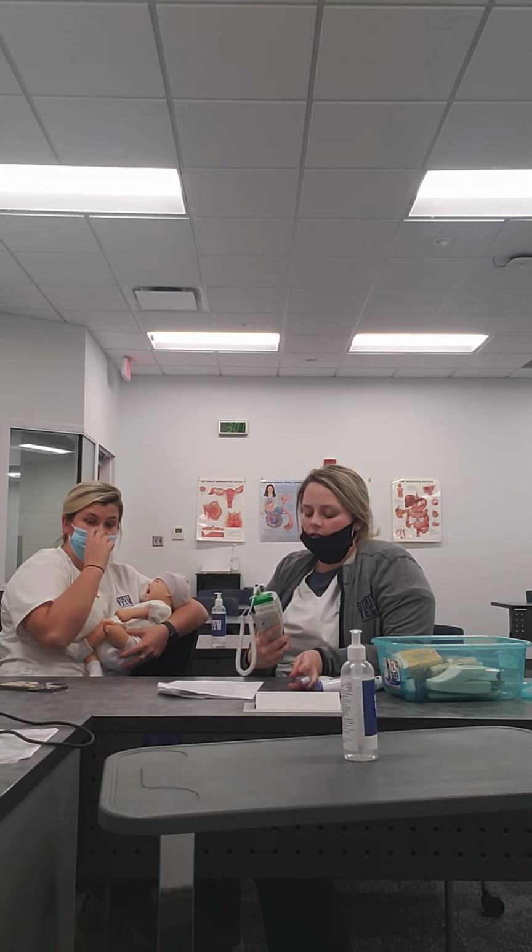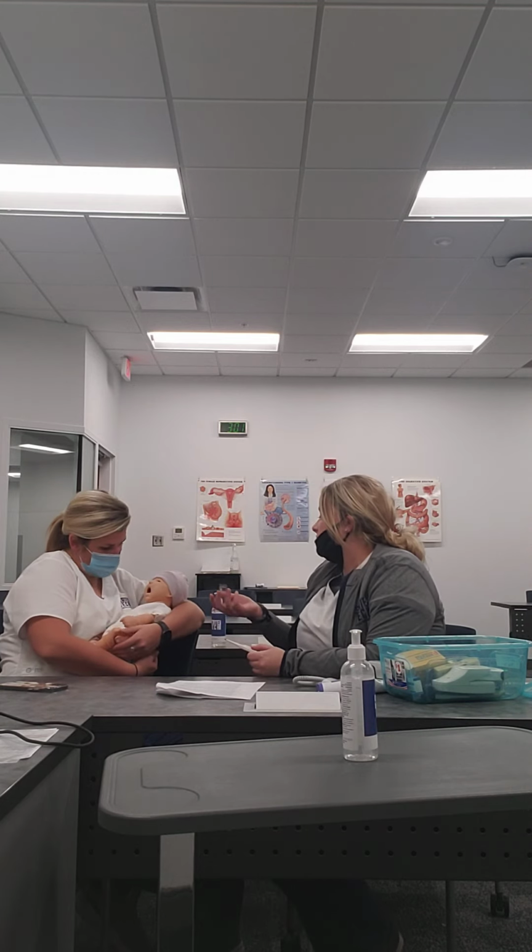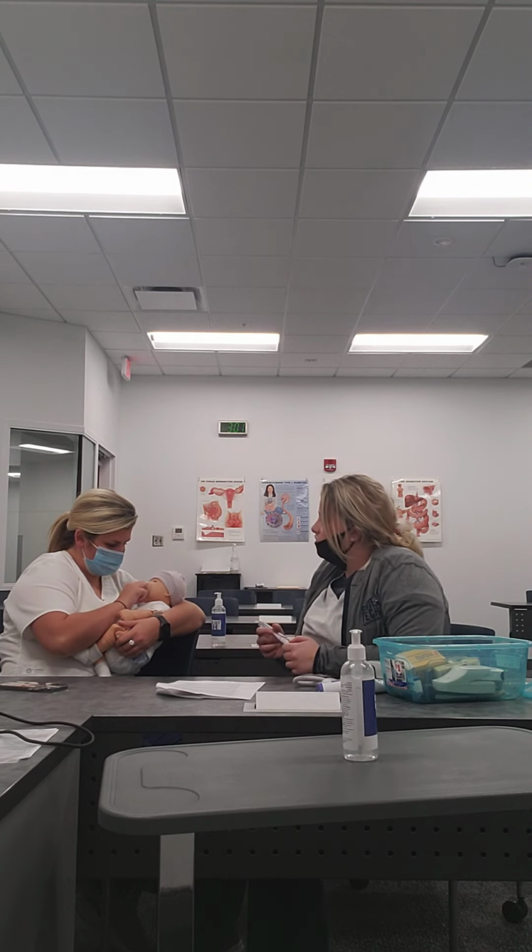Okay. So now we're going to go to oral. Same concept. So we have both of these. Most likely you'll have this one at home. So same concept. You want to turn on the digital thermometer and then place the thermometer under the child's tongue towards the back of the mouth. And with a newborn, it is hard to ask him to keep his mouth closed, but if you could assist in it, you know. Okay. And then remove it when it's done. If you fed Jacob within like 15 minutes, I would wait 15 to 30 minutes because it'll be inaccurate.